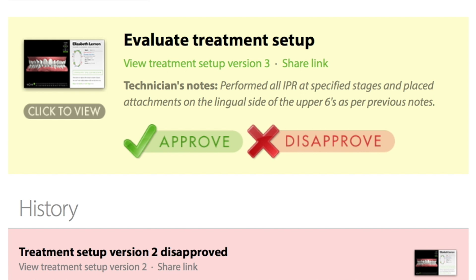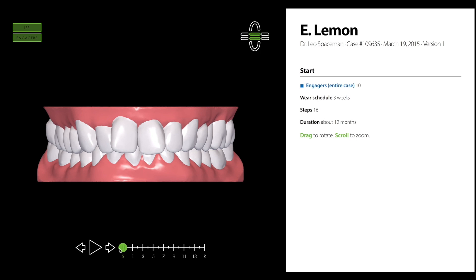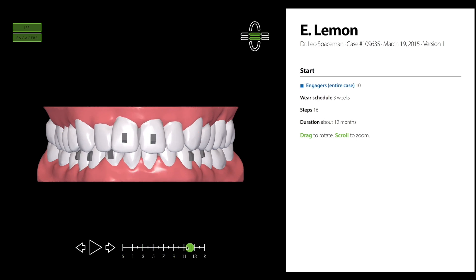To share the treatment setup with a patient or colleague, click Share Link. You'll be given a URL that you can copy and paste to share in an email or text message. Anyone who you give the URL to will be able to view the setup without needing a username or password. This shareable version of the setup redacts the patient's first name and hides the Evaluate button.